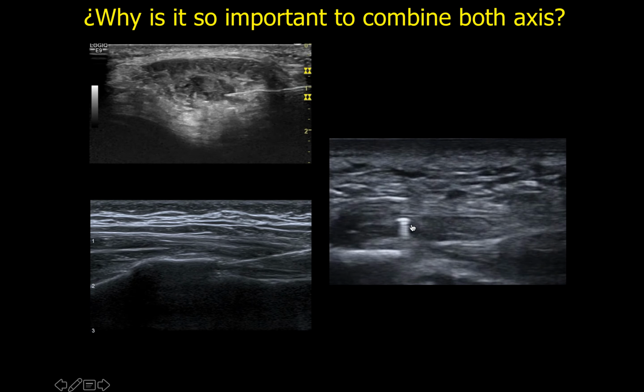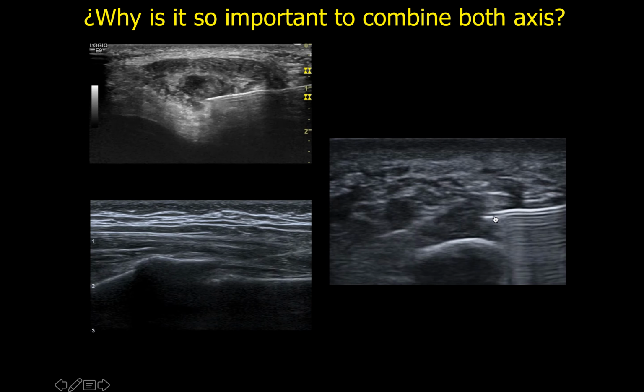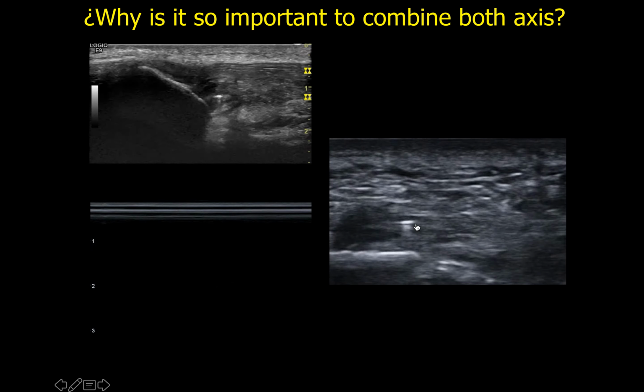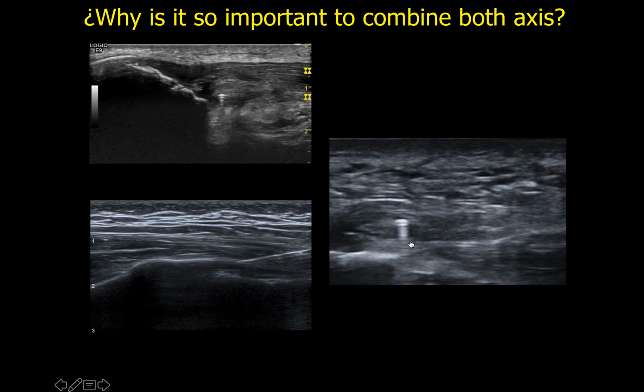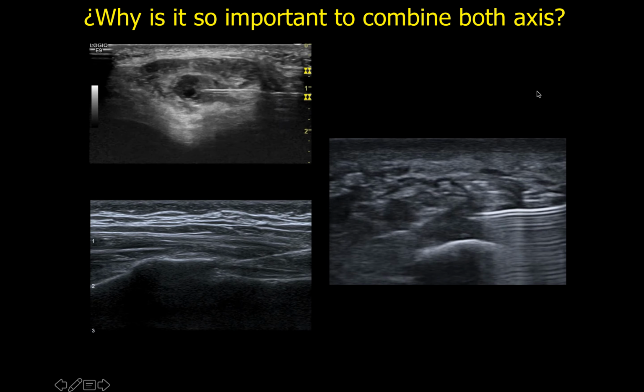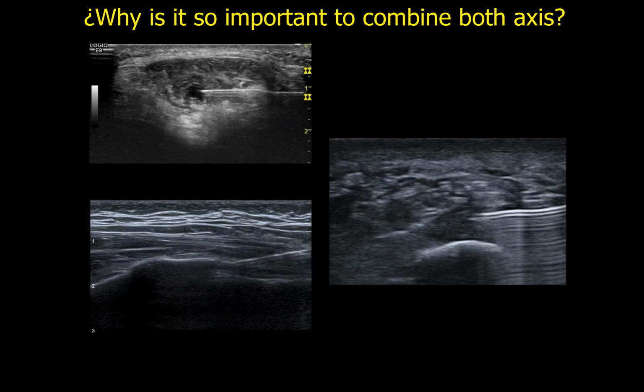Also in this infiltration of the plantar fascia, we see here that we are in the middle of the fascia, but if we want to see if we are proximal or a little bit distal, we have to move and rotate our transducer to know that we are in the correct place.